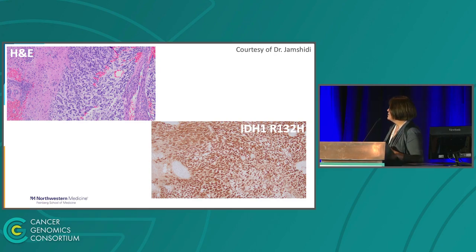You can see loss of 1p and 19q with a loss of heterozygosity, meaning that that was a regional event which stays after doubling of this genome, and that's why we see now loss of heterozygosity with additional relative changes when copy number is not 4 or 8, but in between, either 5 for a gain, which happened after reduplication, or 3 for a loss.